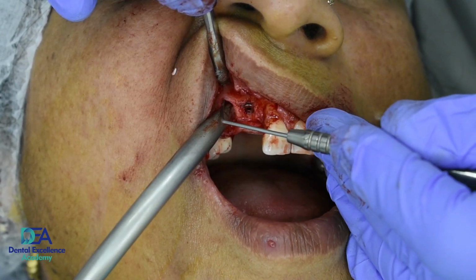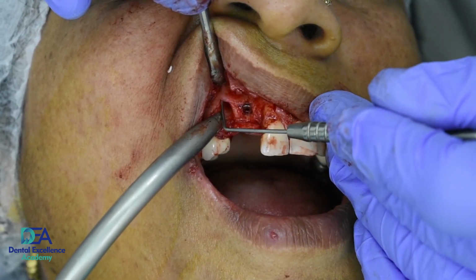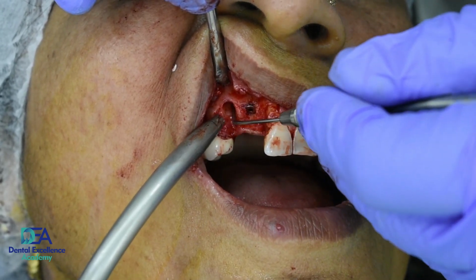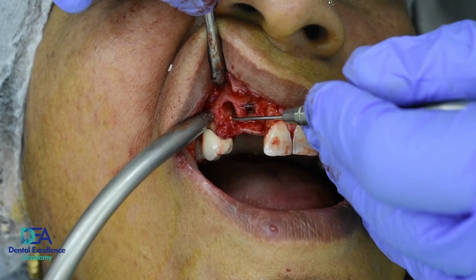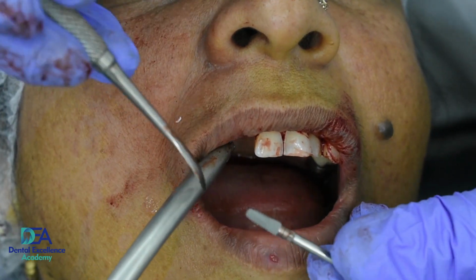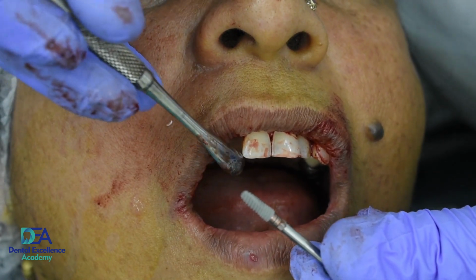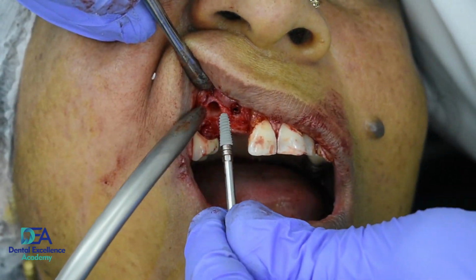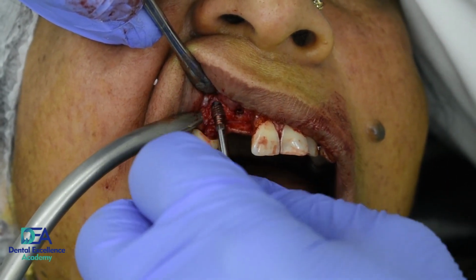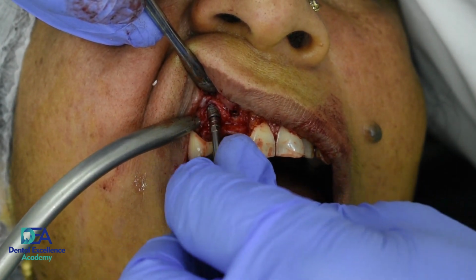Now you have to check for dehiscence on the buccal aspect of the tooth. With the probe I am checking whether there is a dehiscence or not. But with the help of CBCT we have seen. In immediate extraction cases you don't need much osteotomy, so directly you can place the implant. Here I am placing the implant.